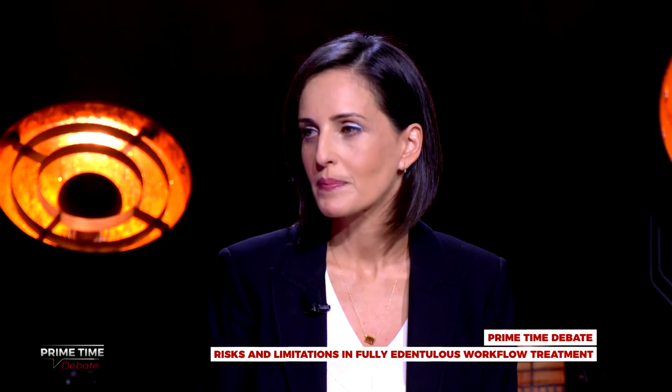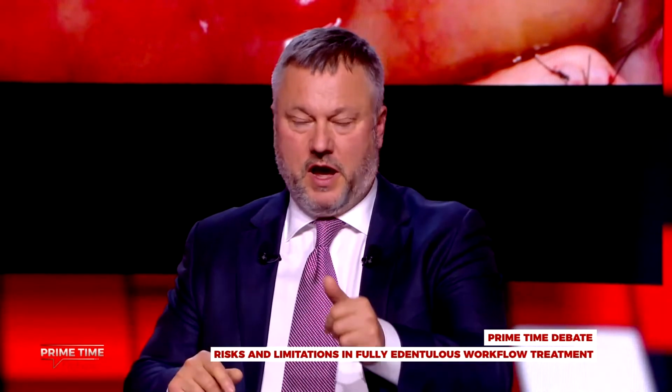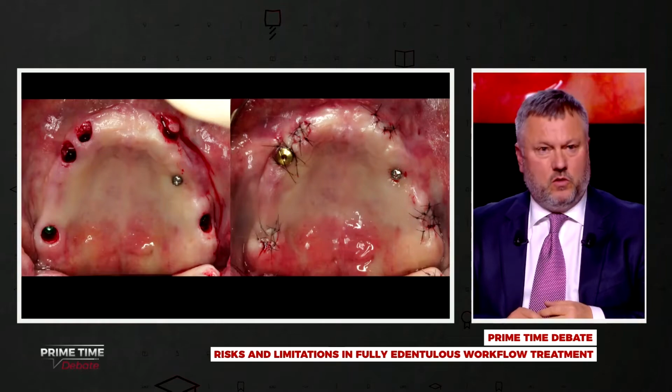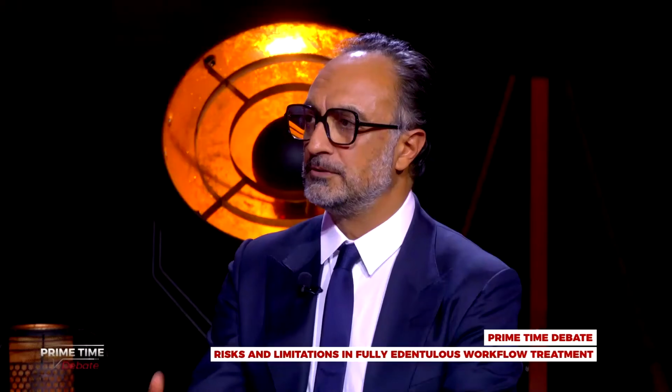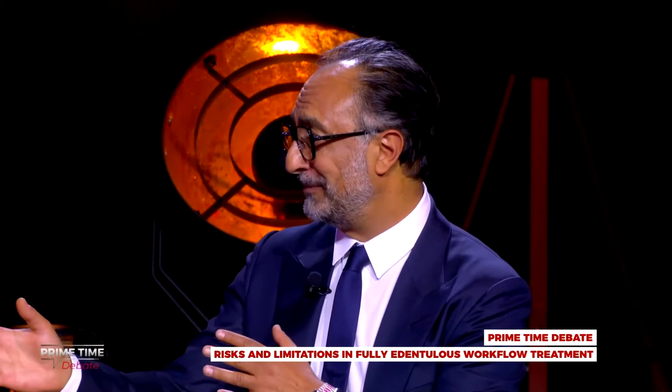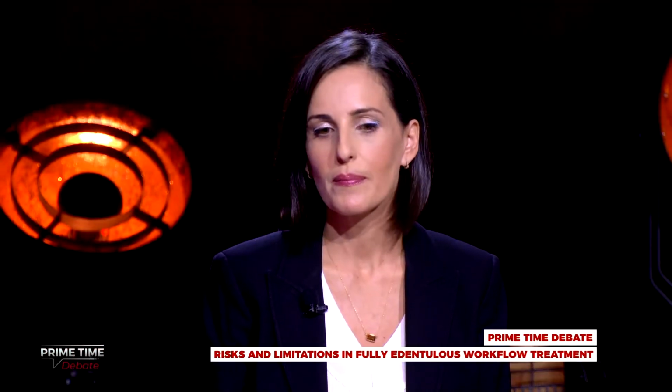So what would be basically wrong is to drill for all the implants with the guide just tissue supported. Exactly. Because you have to really stabilize the guide every time. You drill, you place an implant, and your guide is going to be stable. And then you go again, even if you have to go strategically maybe to the other side, sometimes to the implant in the front. It depends on the situation.